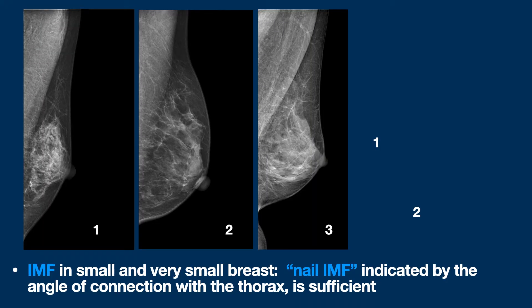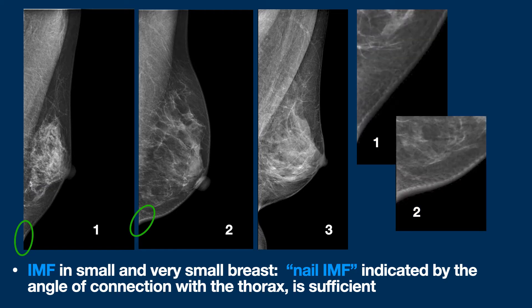Remember that sometimes in very small breasts the IMF is not clearly visible, which is barely noticeable. Examples are in figures 1 and 2, magnified to the right. This is the so-called nail IMF, where the passage of the breast over the chest must be at least perceptible. In figure 3, another example.